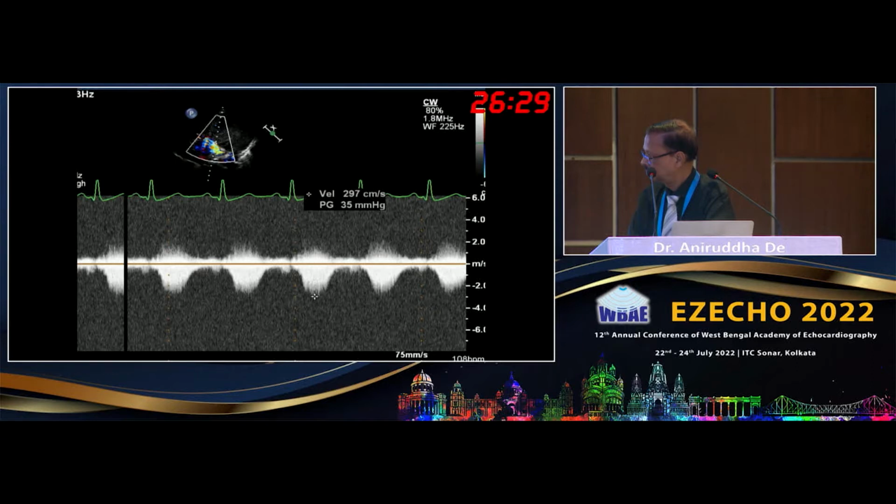The two things one could get help from is by putting color. That is one thing, to see whether it's a vascular mass or not, with the color flow map. It is not vascular, sir. Yeah. The other thing I would definitely do is try to put in the Sonoview or something. That can also tell me how vascular the mass is. We know the limitations of echocardiography, but that would have helped me with this.